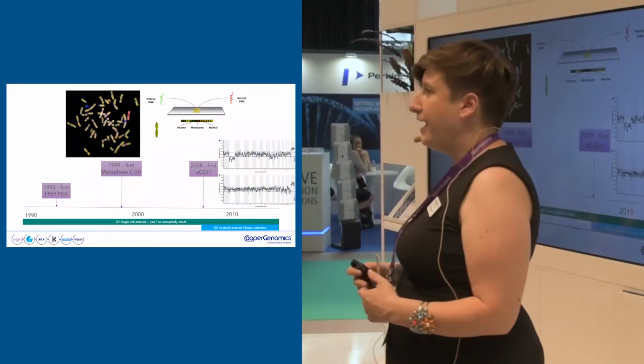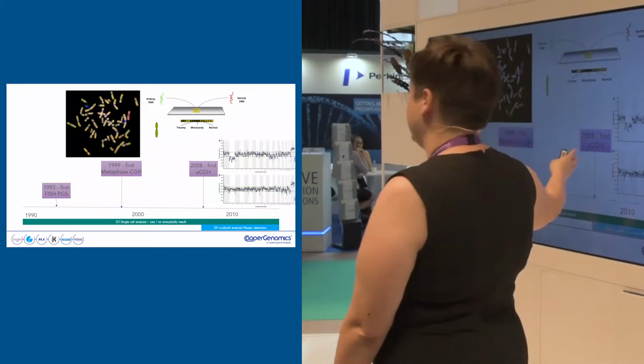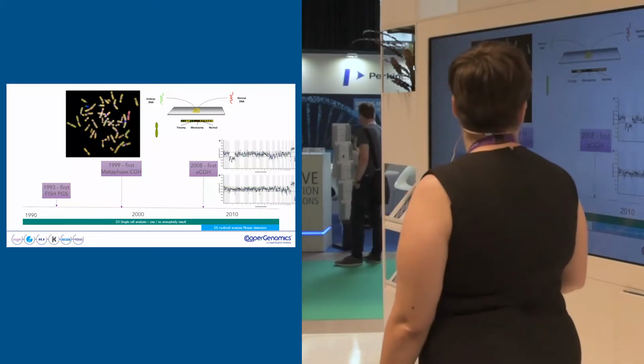So again, much like the technologies, much like the blastocysts, that looked amazing in 2007. In 2018, the lab would call it a fail. And we'll look at what the images look like today.